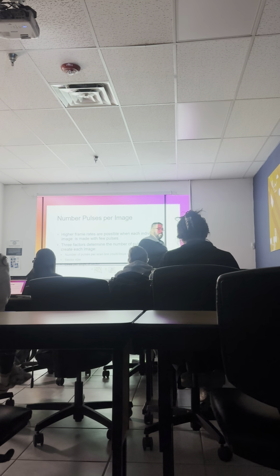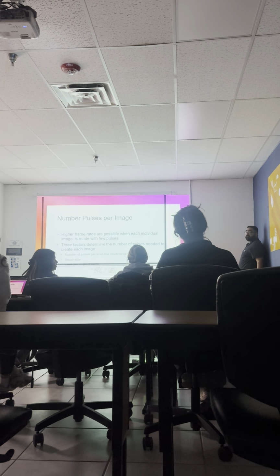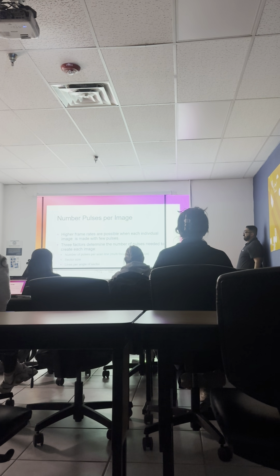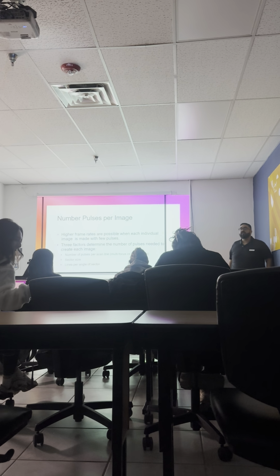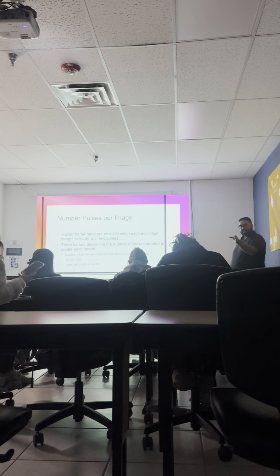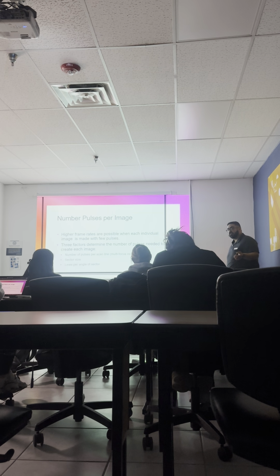I have a question. Yes. Is the line density something you can physically adjust? Yes, there's a button for that, right? There's a button for line density. It's either called line density, or it's a linear knob that you can increase or decrease, or also persistence.